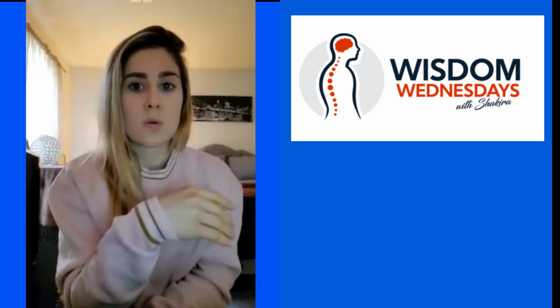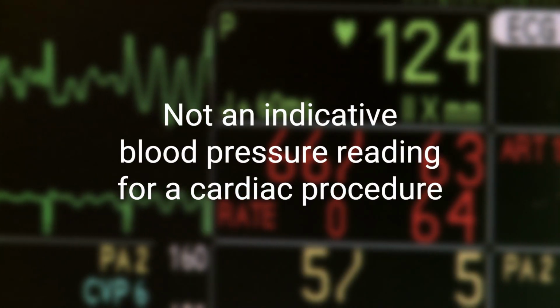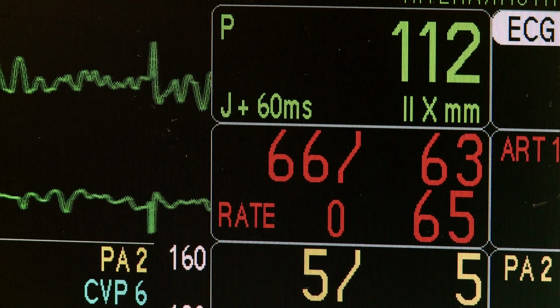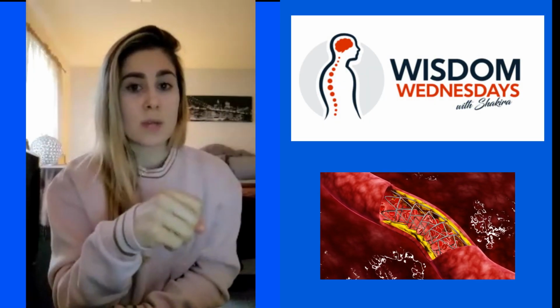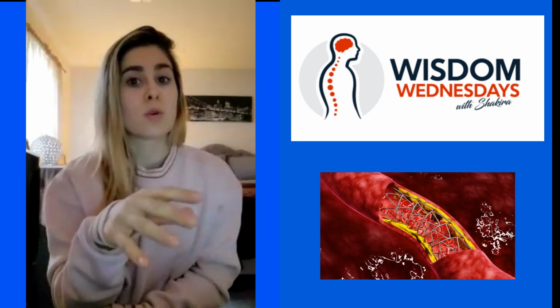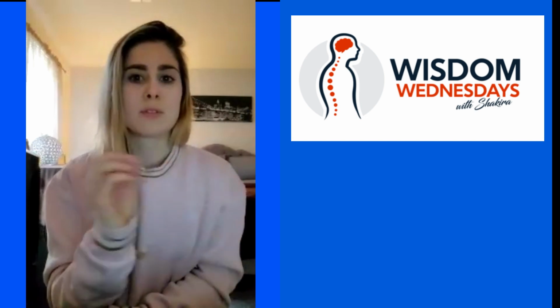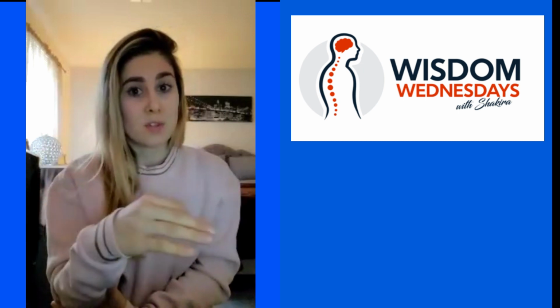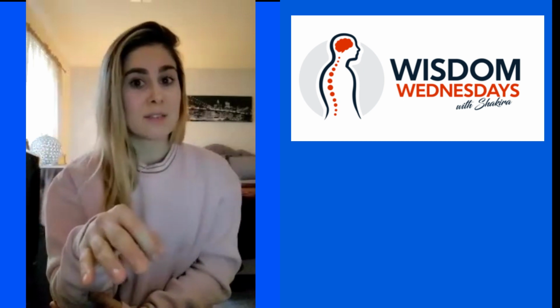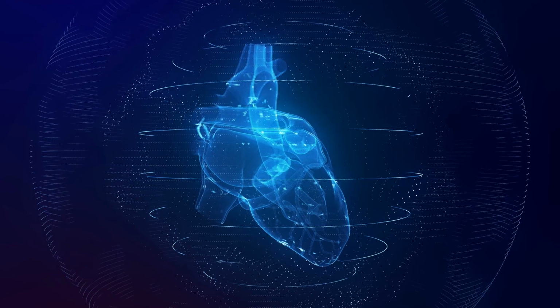They usually like the blood pressure to be up during the procedure so that the cord is perfused after they put the stent grafts in. So there's a lot of little things that you can do to keep the spinal cord safe. But with the addition of motor evoked potentials and posterior tibial somatosensory evoked potentials, that gives you a very high sensitivity and specificity of the spinal cord's safety during the procedure.